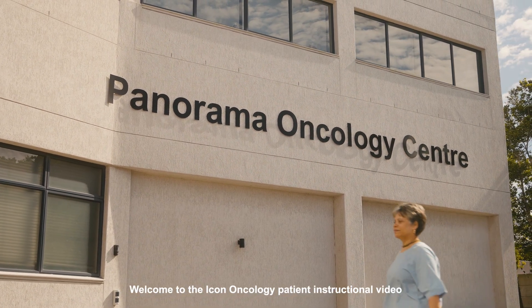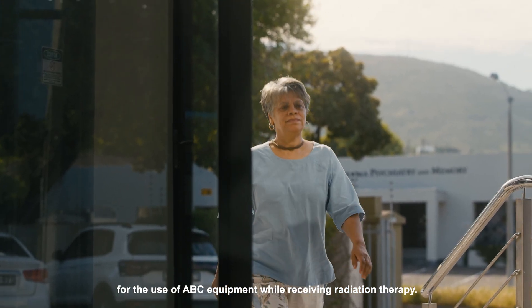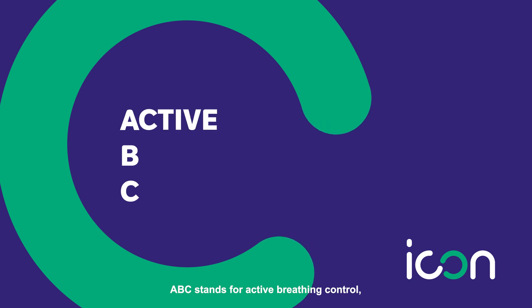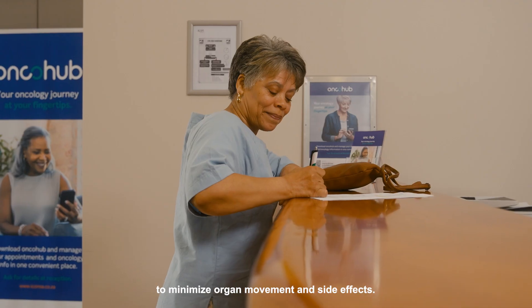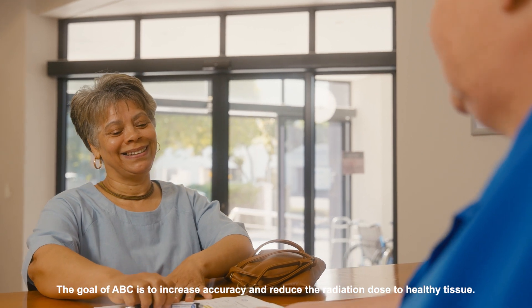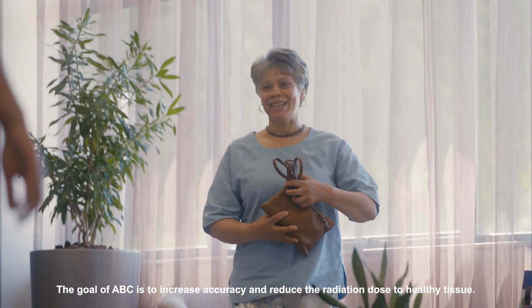Welcome to the ICON Oncology patient instructional video for the use of ABC equipment while receiving radiation therapy. ABC stands for Active Breathing Control and it's used at selected ICON radiotherapy units around the country to minimize organ movement and side effects. The goal of ABC is to increase accuracy and reduce the radiation dose to healthy tissue.